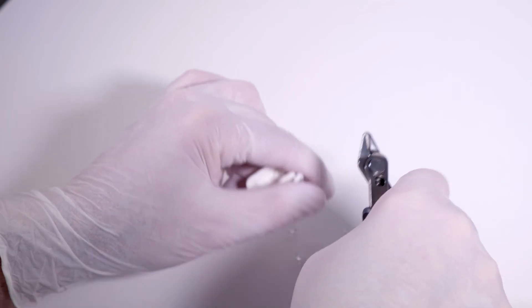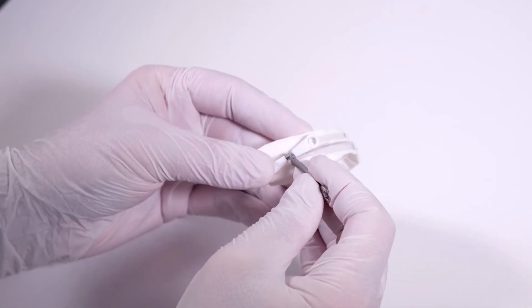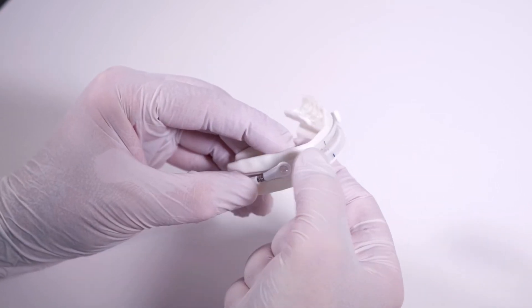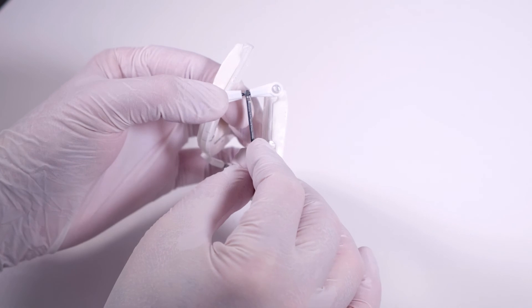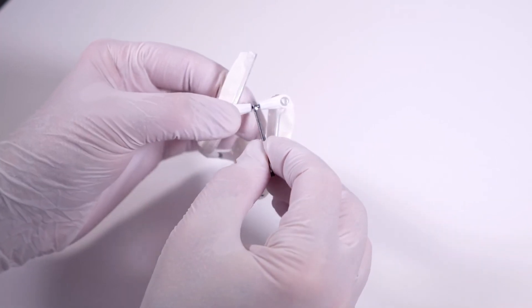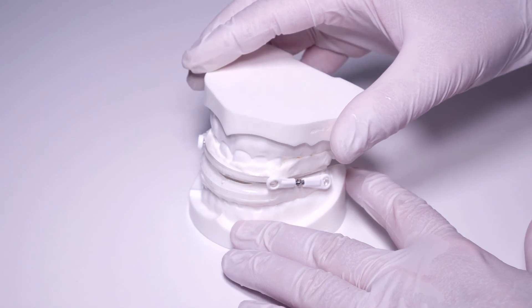The extent of the lower jaw advancement depends upon the length of the connectors — the shorter the connectors, the larger the lower jaw advancement. Each connector has a spindle screw in the centre. The length of the connectors can be altered by turning the spindle screws with the spanner. The lower jaw advancement is largest when the screws are screwed in completely.